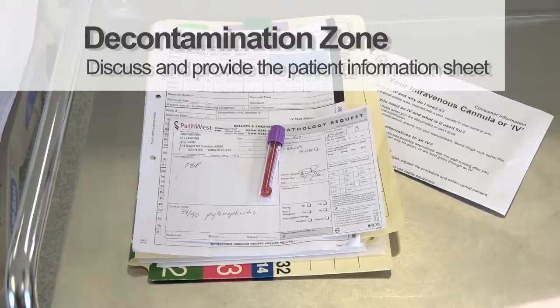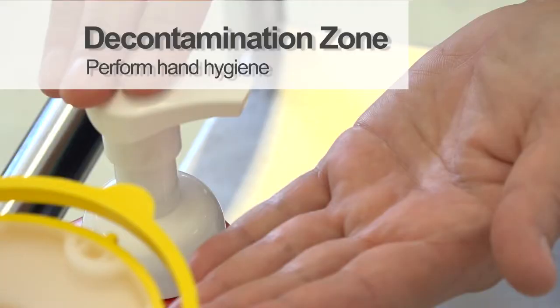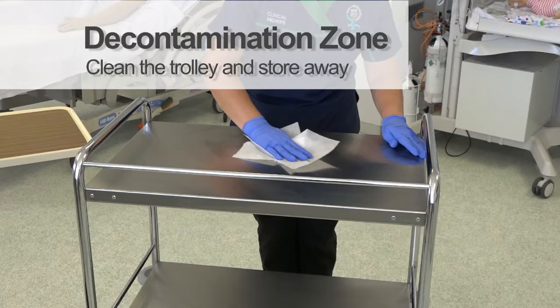Complete the blood sample documentation and discuss and provide the patient with the patient education information sheet. Perform hand hygiene, clean the trolley and store away for next use.